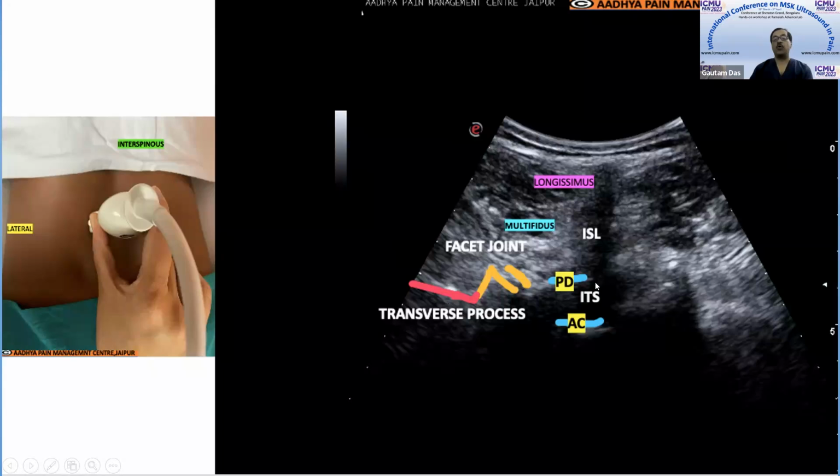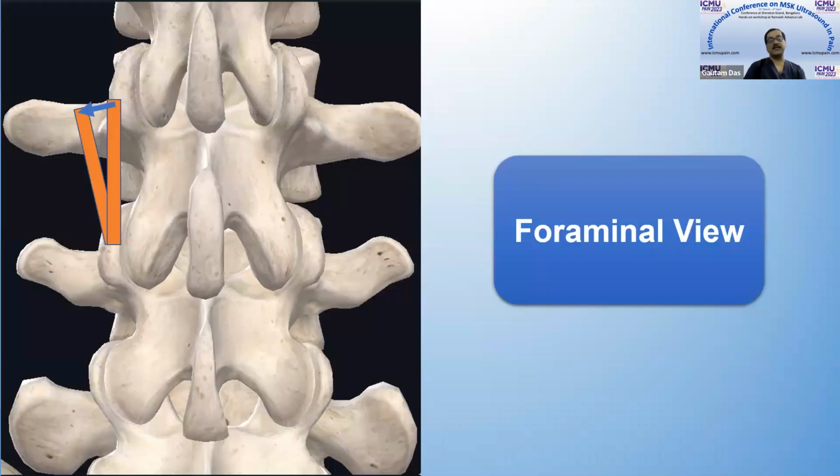If you wish to do a spinal epidural, this is not the view, but you can have a clear idea of how deep the posterior complex is and how deep the anterior complex is, so that when you are doing a procedure, you have a clear idea of how to reach and where not to reach. Now I'll show you another view, this is our own Daradia's technique.